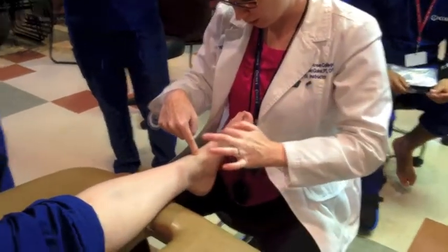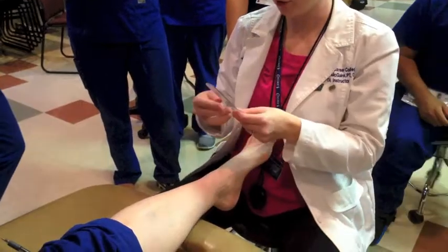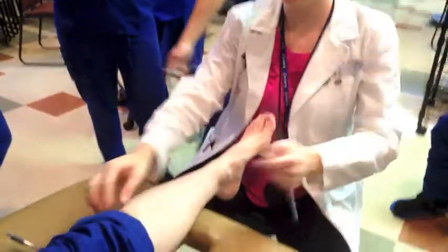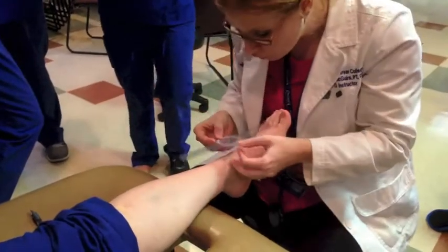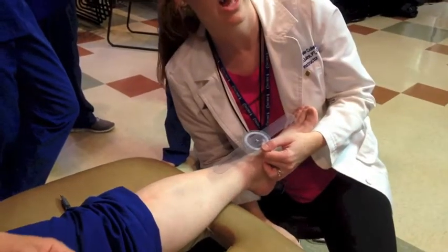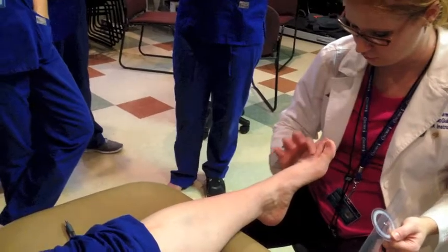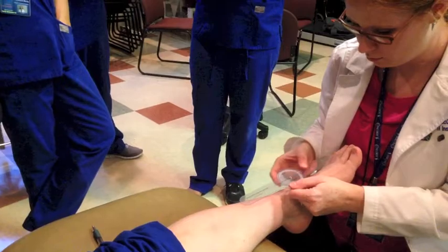The fulcrum of the ankle is going to line up with the second toe. My stationary arm is going to go mid-tibia all the way up to the tibial tuberosity. The fulcrum is between the malleoli and the stationary arm goes up there. Now my moving arm is going to line up with the anterior midline of the second metatarsal — so I look at the second toe, find the second metatarsal, and that's what I want to line up with.